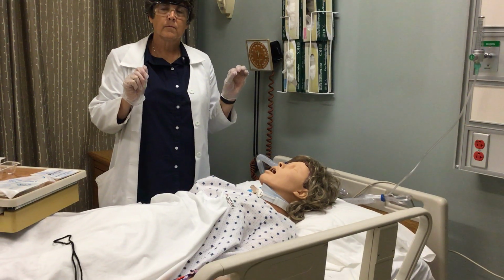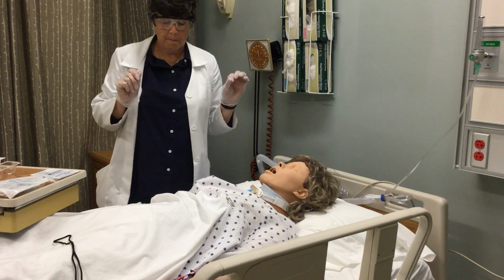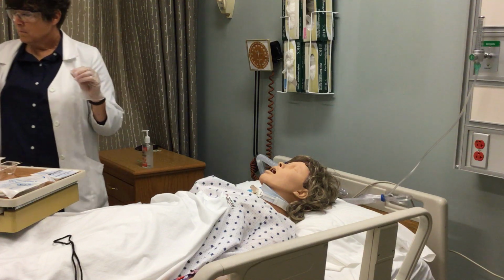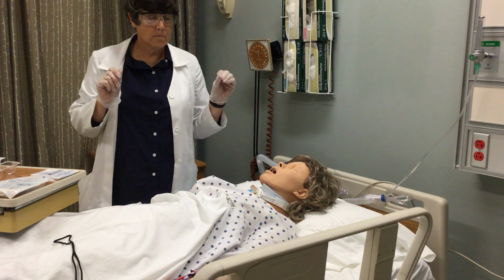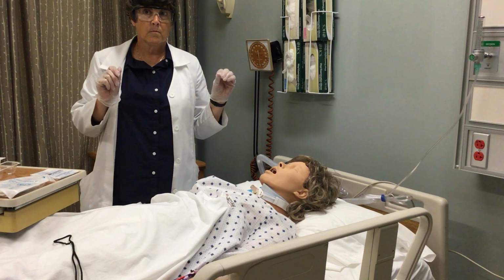If you have a patient with a non-disposable inner cannula, you will follow these directions. Use the non-dominant hand to unlock and remove the inner cannula. Using strict aseptic technique, touch only the outside of the cannula. Drop the inner cannula into the basin of normal saline.